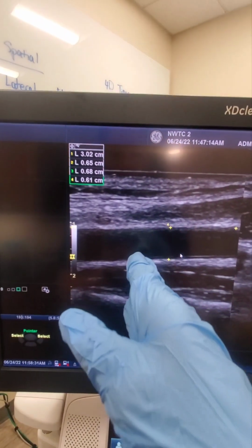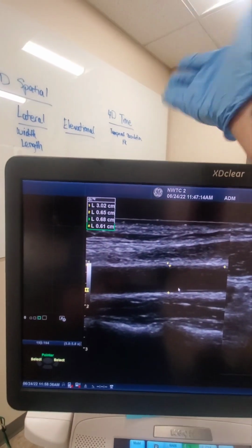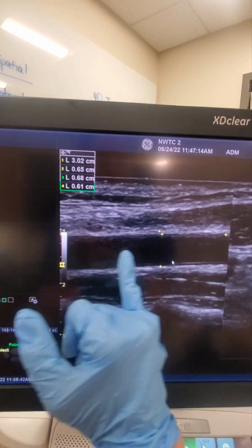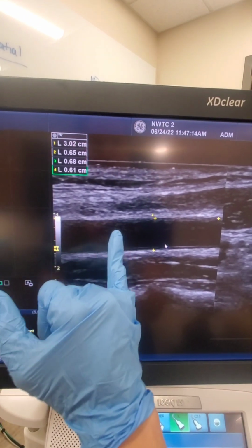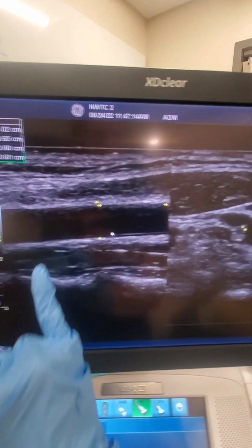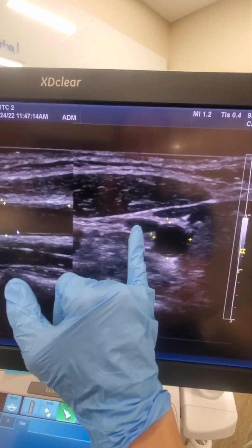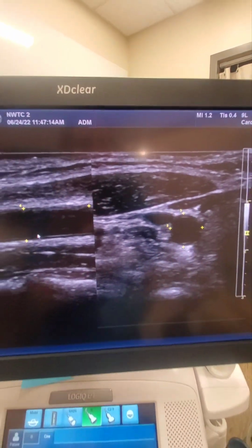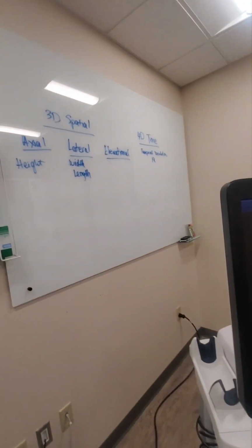Okay, it's like that dimension, as I was scanning, that would be on the other side, back here, on the other side of my monitor, or toward me. And that's what fills in these echoes, that fills in this clear cystic space that's not supposed to have these soft tissue echoes. That's that elevational resolution. Okay? Now this one cleared out nicely, except the vein didn't here. So when we have the soft tissues on either side that are filling in our echoes, that's often poor elevational resolution.